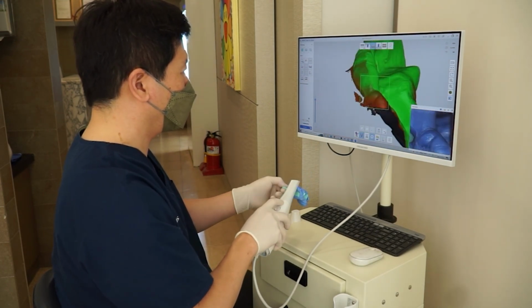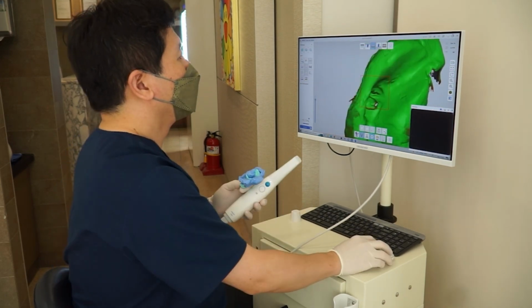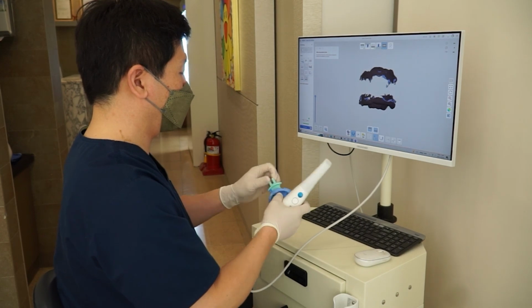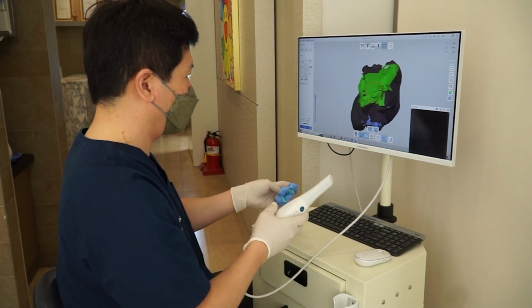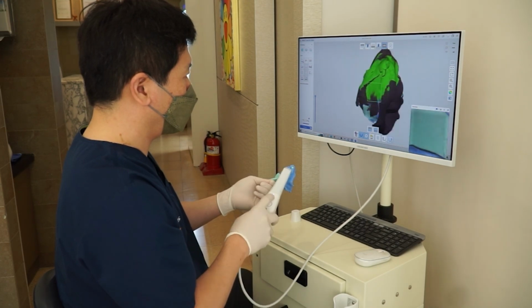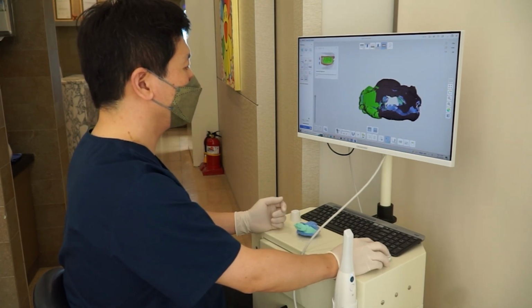In this video demonstration, we show the scanning process of a centric tray that has captured the impressions of both the upper and lower arches of an edentulous patient. The procedure starts by scanning the impressions in the tray to get a digital record of the bite registration. After the initial scan of the impressions, we focus on scanning the lateral sides of the tray.